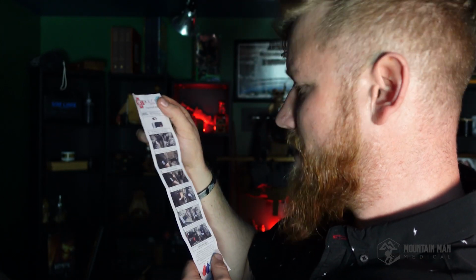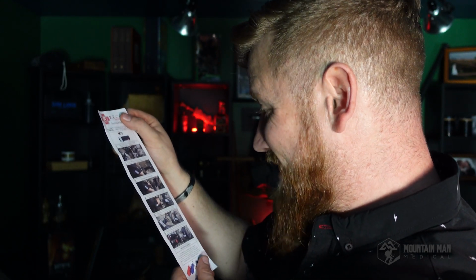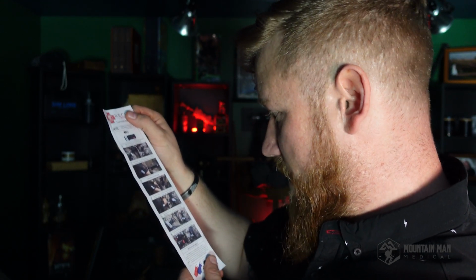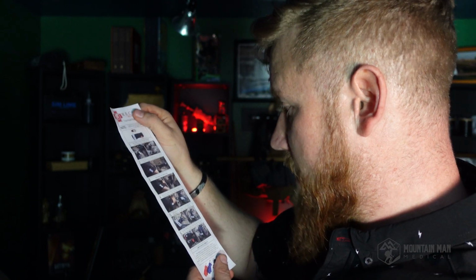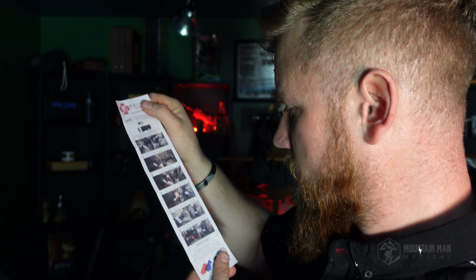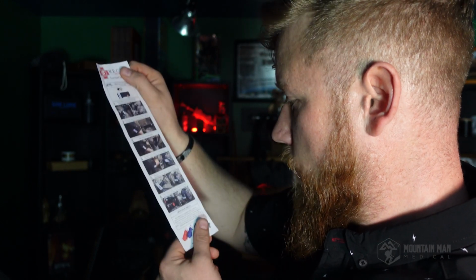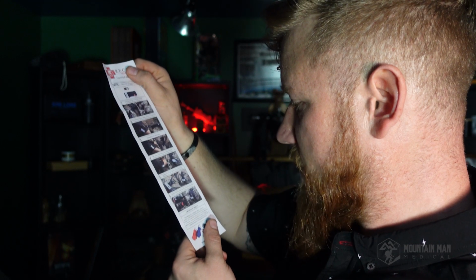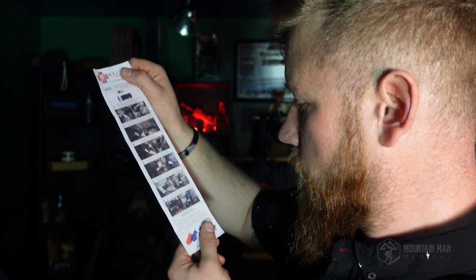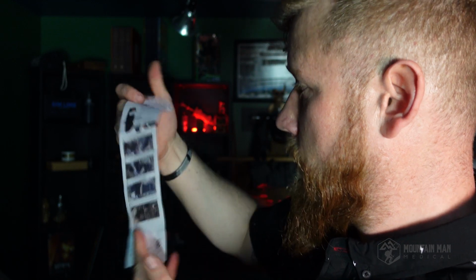Who wrote this? Twist windlass until bleeding stops. Standard. Seat windlass inside windlass clip. Check for bleeding. If bleeding continues or begins again, tighten the windlass. Secure the extra band over the windlass clip and around the rod. Place timestamp over the band and windlass. Record time. If bleeding continues, apply a second tourniquet directly above the first. Remove the slack, tighten, and seat windlass. Reassess.